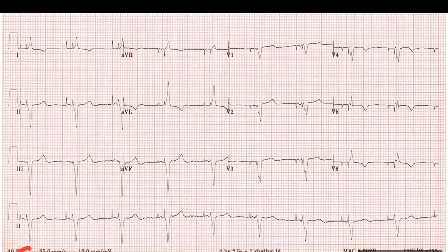Spikes don't have to be the exact same morphology in all the leads, but this is definitely a spike. You don't see it in lead III, but that doesn't mean it's not a paced beat. Just because you don't see a spike here, you follow it from the other leads. You could see something here, you could see something here, then you follow it down. So this one here, there is something that resembles a spike. It doesn't have to be the same exact thing in all the leads. This is the ventricular QRS that's generated by the paced ventricular output.